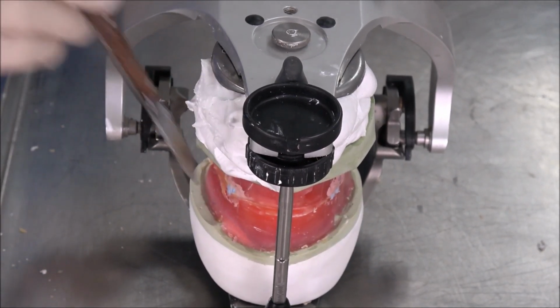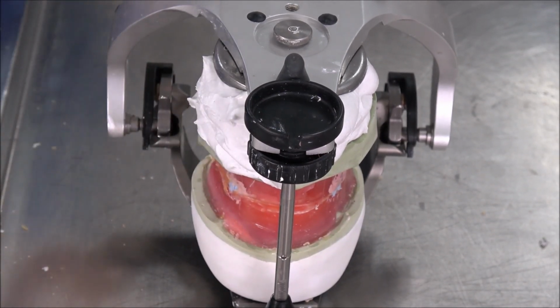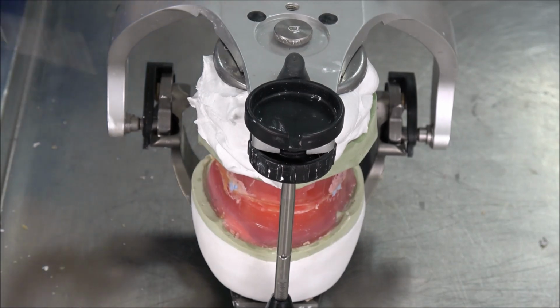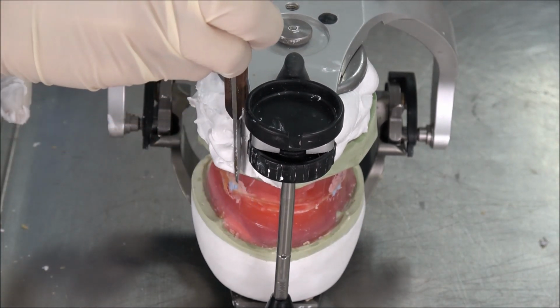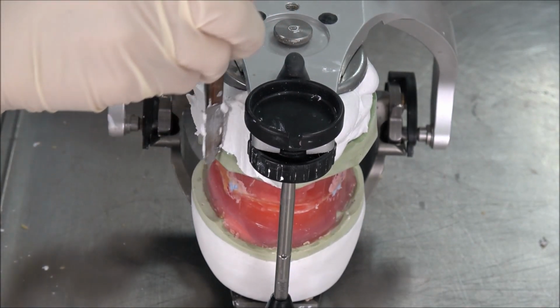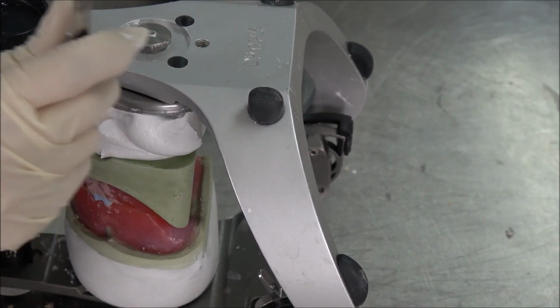We remove all the excess, but when you remove the excess, make sure you won't move your articulator. Just leave it on the same position. So you can remove using your wax knife. Remove slowly. Okay, remove all the excess.